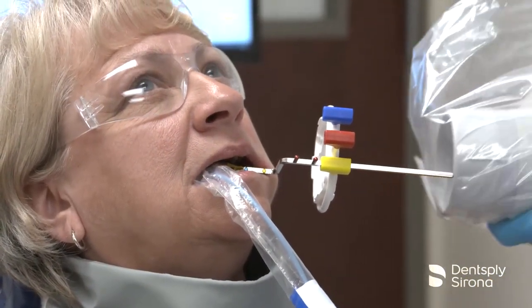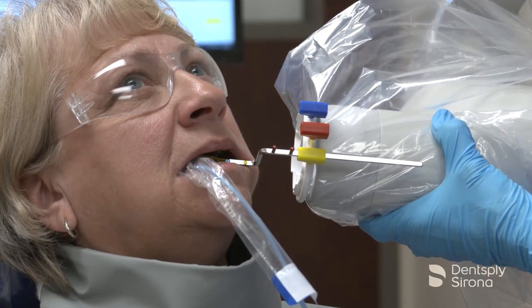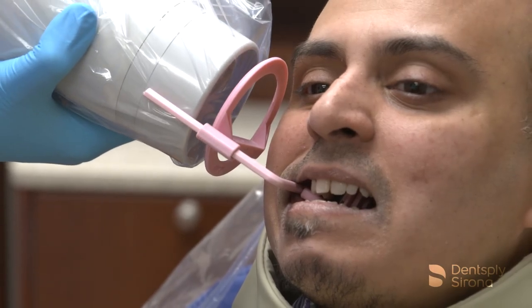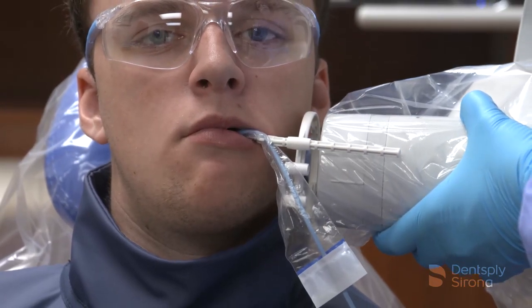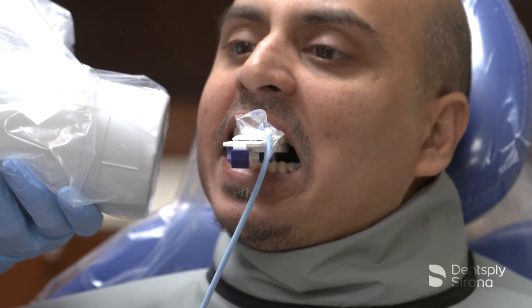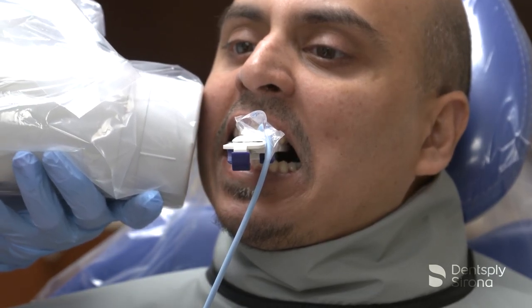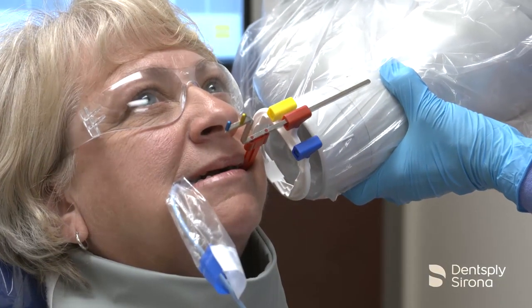Dental radiographs are valued diagnostic tools when the image quality is adequate enough for proper interpretation. To do this, it is imperative to correctly place the image receptor in the mouth and ensure that the primary x-ray beam is centered and aligned correctly in both the vertical and horizontal angulations. At this time it is crucial to minimize patient exposure to radiation. Successful images require the use of careful technique and precautions to maximize their diagnostic and interpretive value.